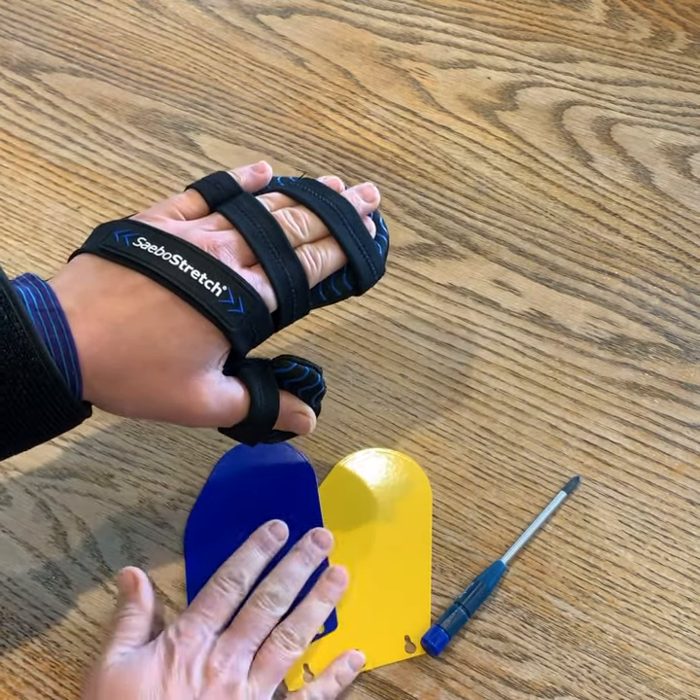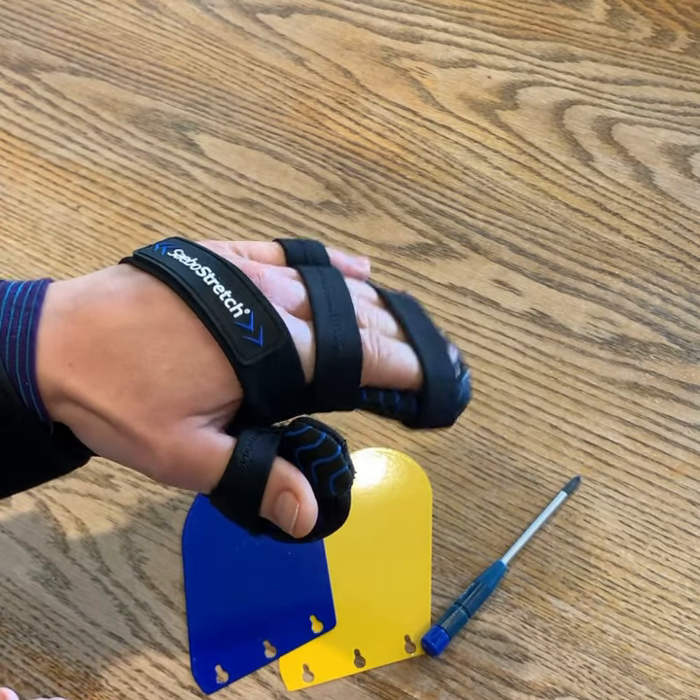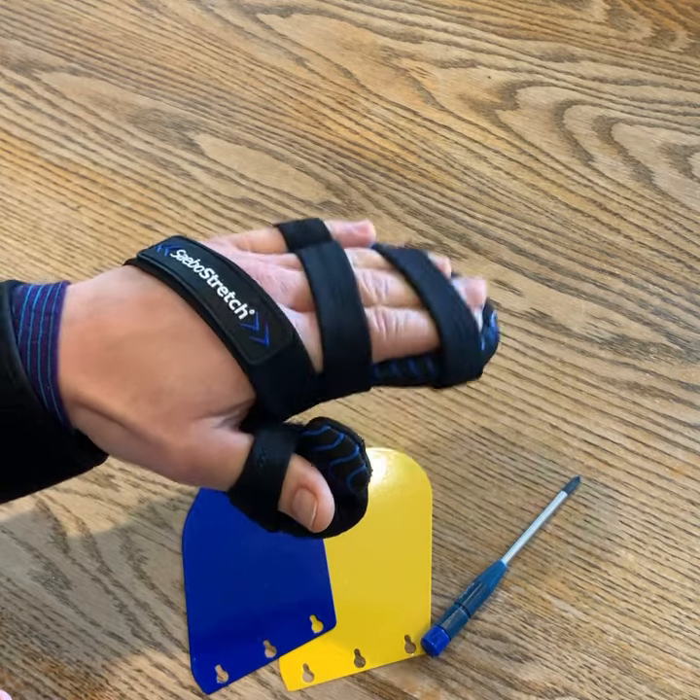You then get different resistance hand pieces that allow you to accommodate different amounts of reaction and resistance within the splint.